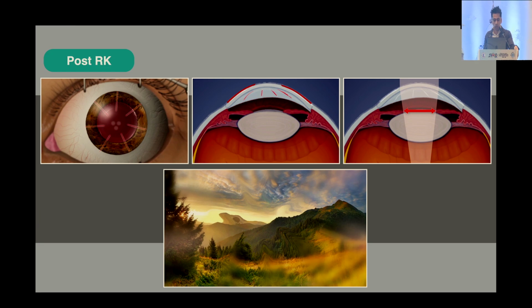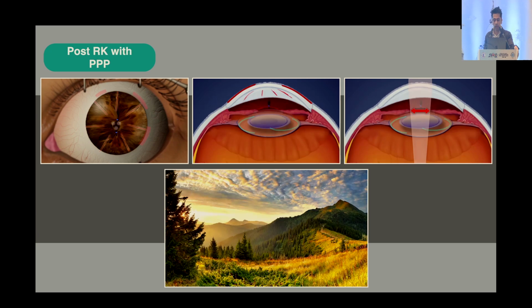Next, post-RK patients usually see something like this through a dilated pupil. The minute you're able to bring the size down to 1.5 to 2 millimeters permanently, that's when you can really impact this visual effect and the refractive change. This is the same principle that is being followed for the AcuFocus and the IC-8 lens, the pinhole IOL.